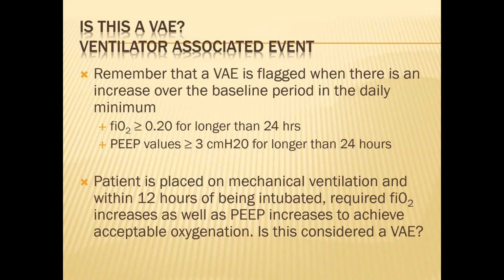So with a high plateau pressure, we don't want to further damage the lungs by delivering a higher pressure. So we allow the CO2 to be high and the pH to be acidotic.